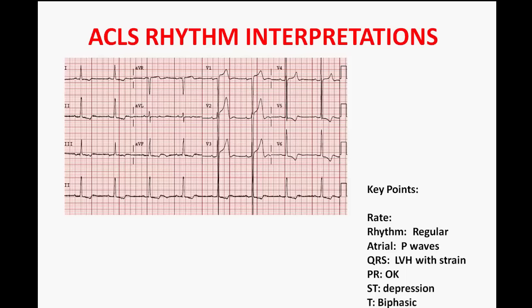Here we see some ST elevation, but that is a normal variation we see in patients with left ventricular hypertrophy, and it doesn't necessarily suggest any evidence of an acute myocardial infarction.